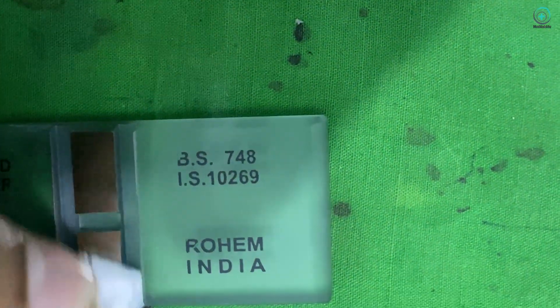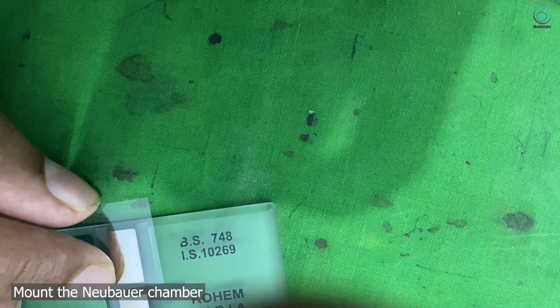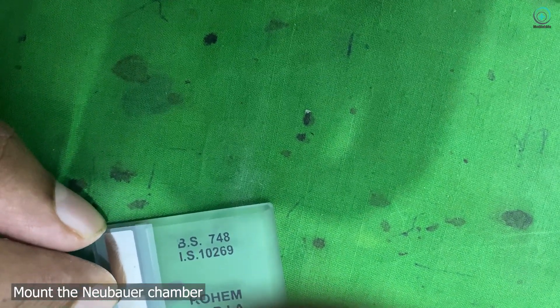Step 4: Preparing the Neubauer chamber. While we wait, let's prepare our counting chamber. We're using a Neubauer chamber for this.